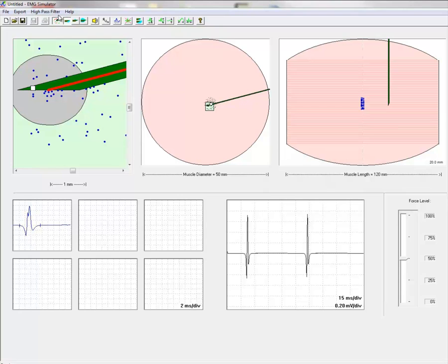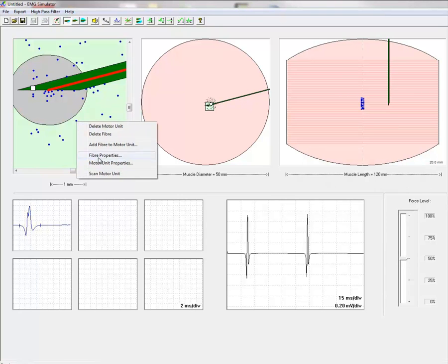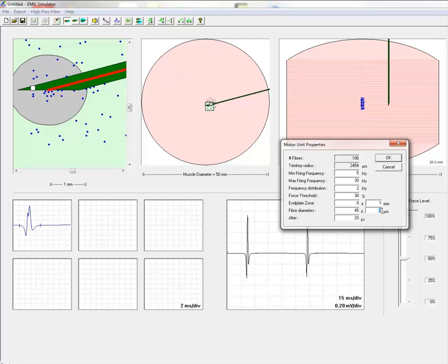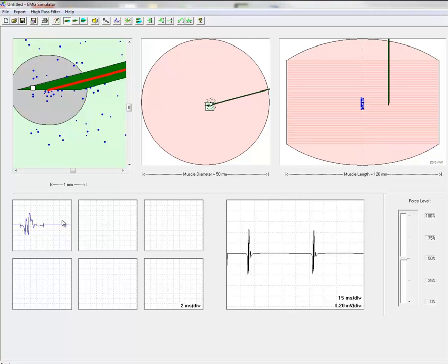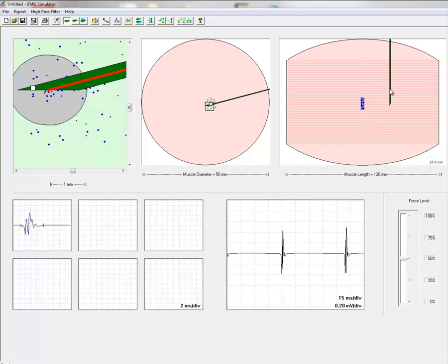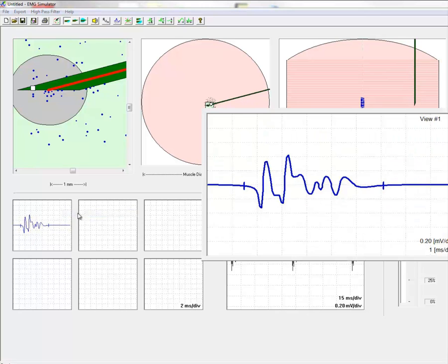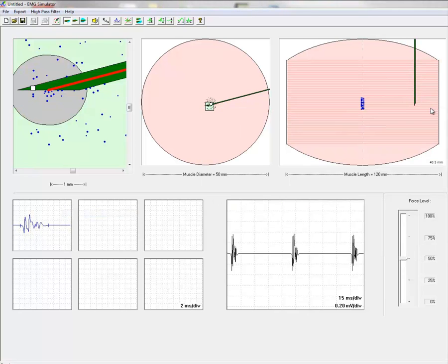Often the newly re-innervated muscle fibers show different degrees of atrophy which occurs during the time when the fibers are without innervation. Since the conduction velocity in the muscle fibers is related to fiber diameter we may see this variable atrophy as increased dispersion of the motor unit potential. This is best seen away from the end plate where the effect of fiber diameter is much more pronounced than close to the end plate.